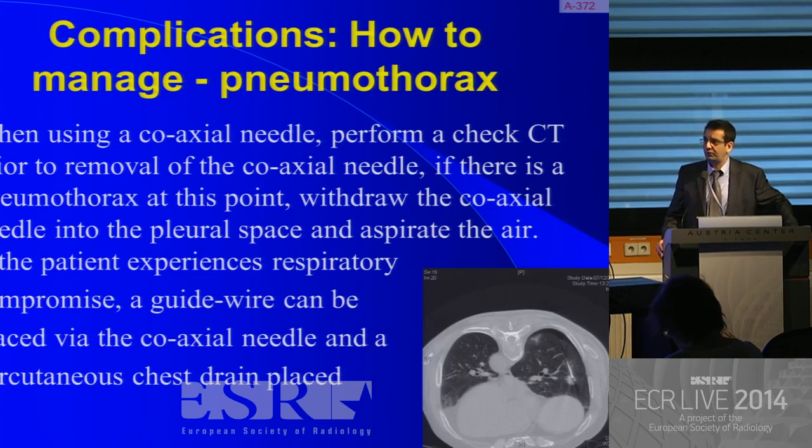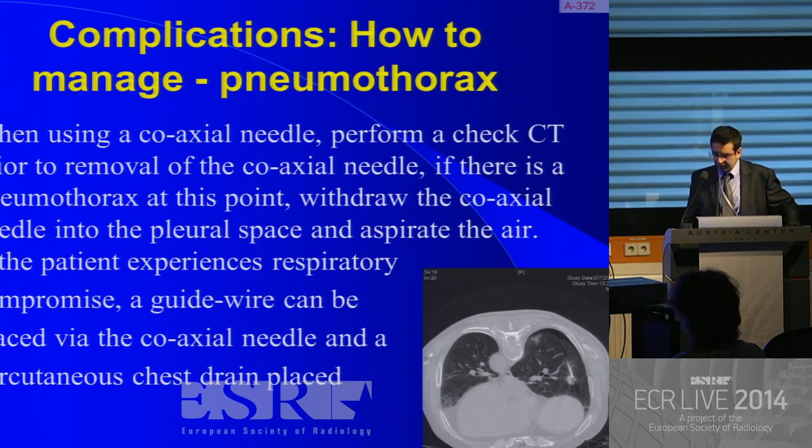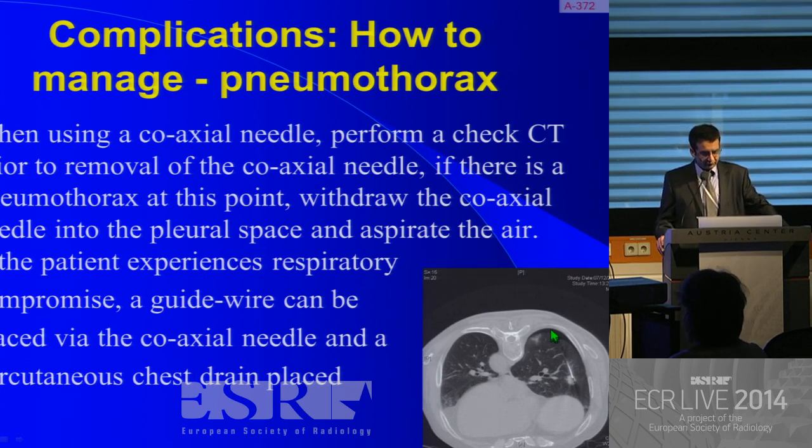If you do have a pneumothorax, having a coaxial needle technique is very helpful because, like in this image here, if you see a pneumothorax following the biopsy, you can retract your coaxial needle into the plane of the pneumothorax and then aspirate. And if there's further compromised respiratory function, you can even place a percutaneous drain.